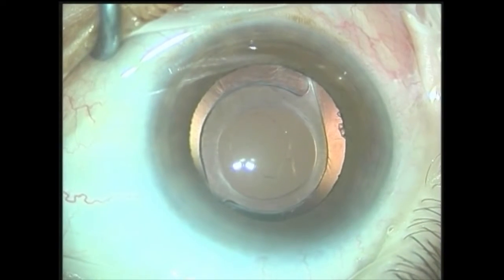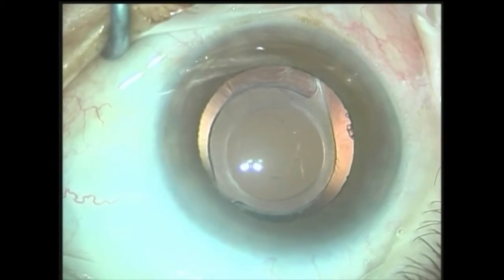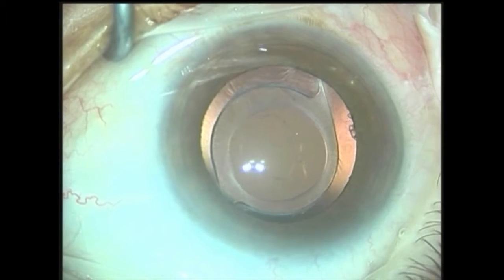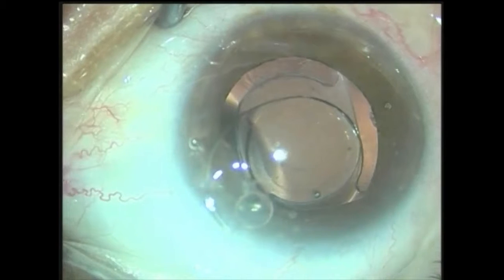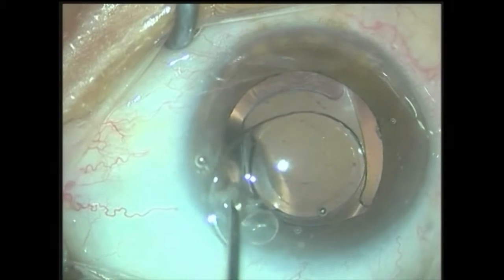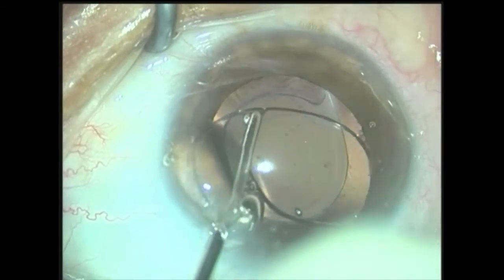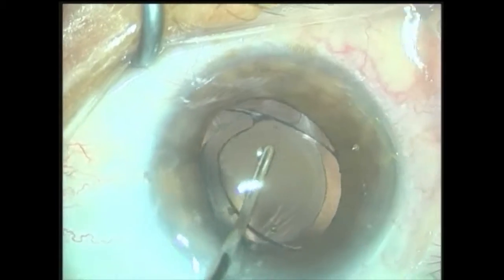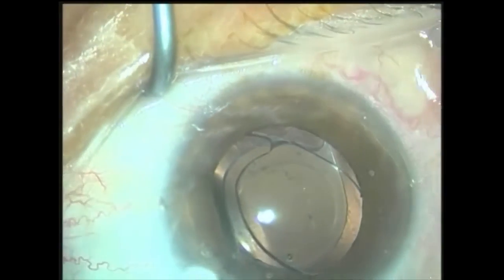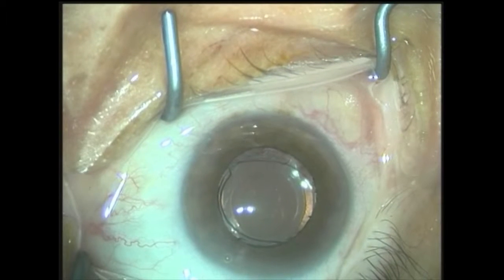This case also illustrated that implanting a secondary IOL in a piggyback fashion in the sulcus can successfully treat severe pseudophakic photic phenomena. Until the unsolved issue of unwanted images is elucidated, we should consider performing piggyback implantation, since it does not have the same potential inherent risks associated with an IOL exchange.